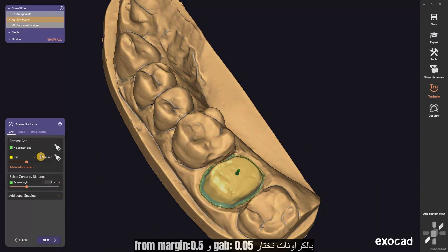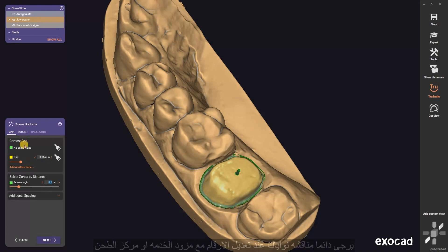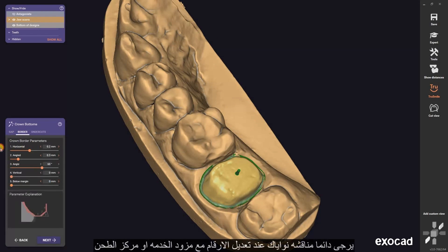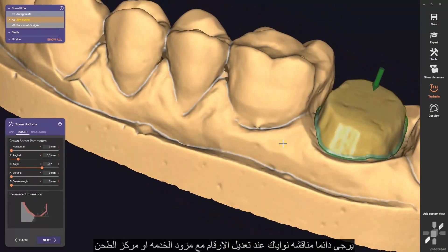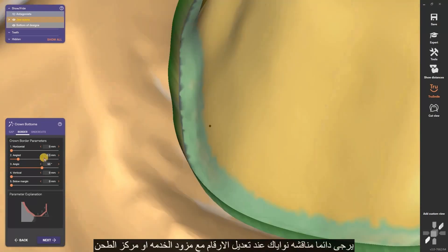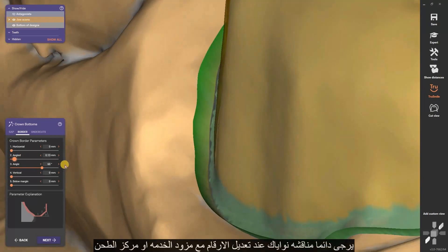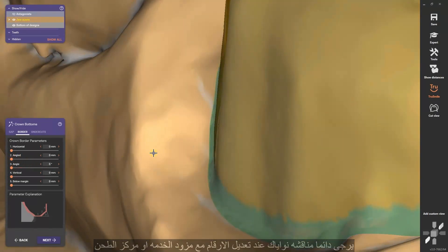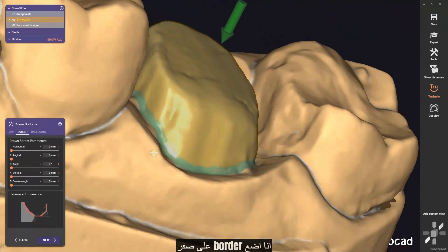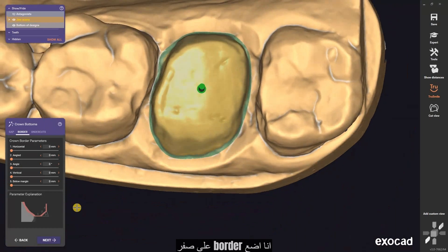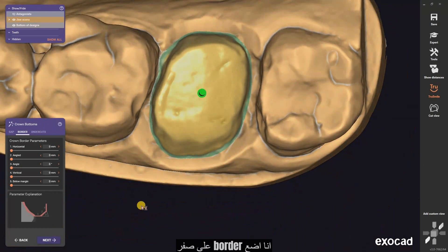In crowns, we will put the gap at 0.05 mm and from margin 0.5 mm. Please always discuss your intentions when adjusting numbers with your service provider or milling center support. I put all the border on zero.